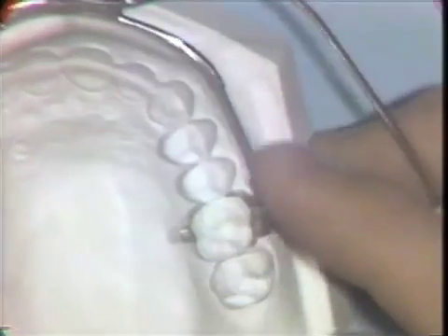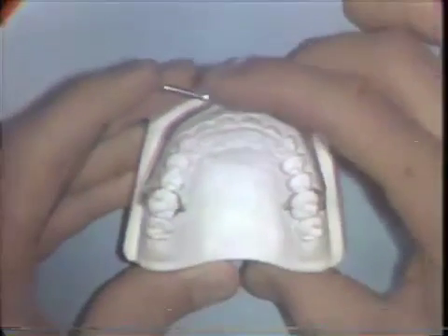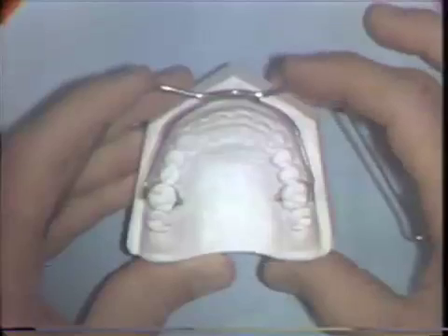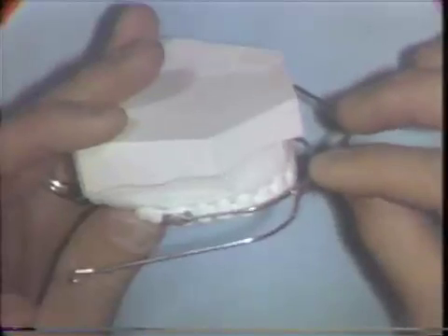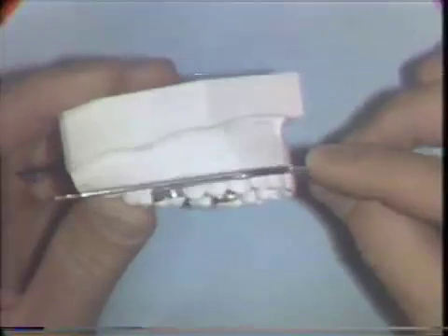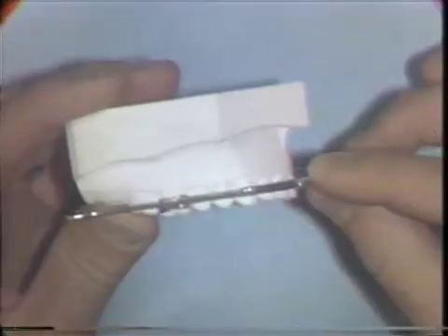And the Facebow must be passive and it must be symmetric. In other words, the solder joint has to be centered. Lastly, the inner bow should be parallel to the occlusal plane, and it should be parallel to the outer bow of the Facebow.